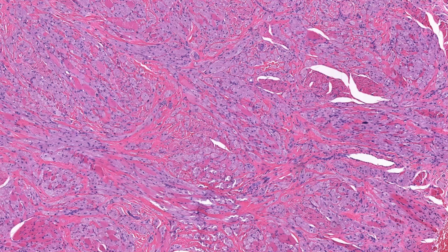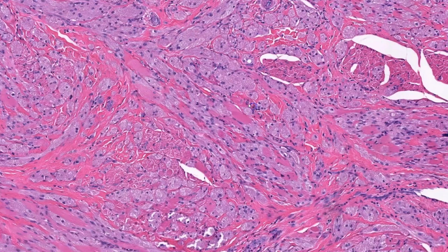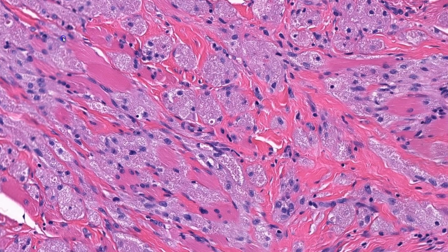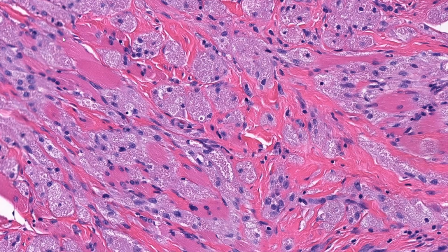Finally, at high power, I'll confirm what I saw at medium power and assess the nuclear and cytoplasmic features, including the presence of atypia, mitotic activity, and necrosis. For example, I can see that tumor cells here have abundant, finely granular eosinophilic cytoplasm, and I can also appreciate some larger granules that separate themselves from the smaller granules, almost like a force field or a halo.